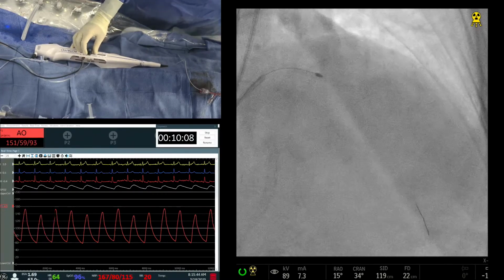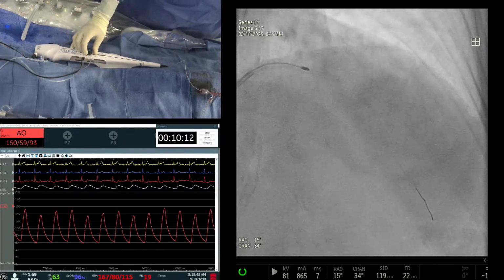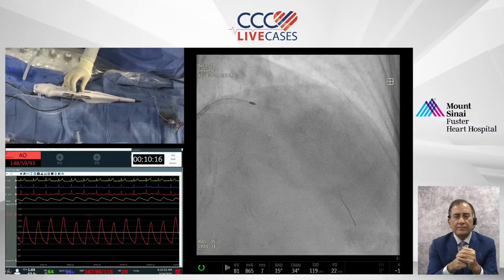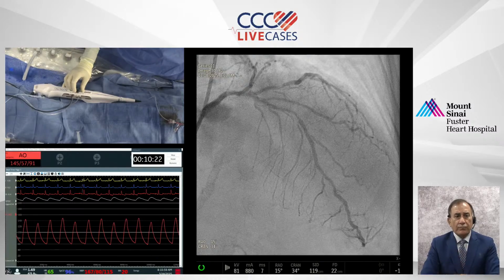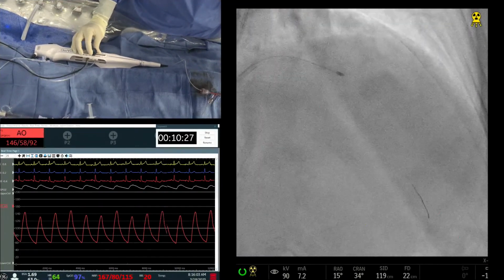So when you did the RCA, you had used a pacemaker there? Yes, we use a pacemaker with the rota burr. All 3 lesions took quite a bit of time. And then the proximal segment required IVL, truly the proximal segment.